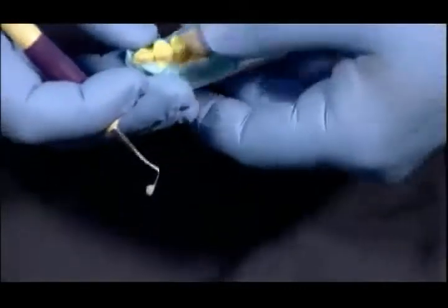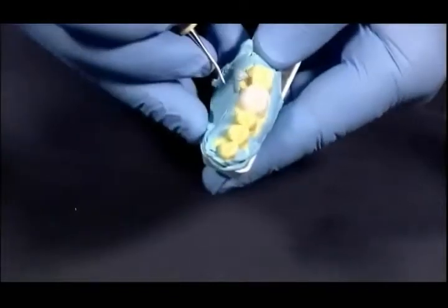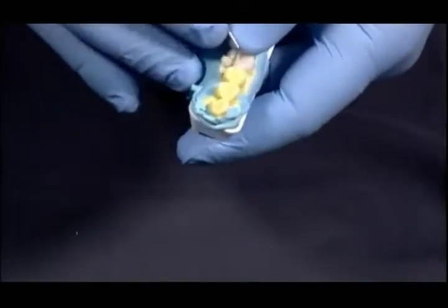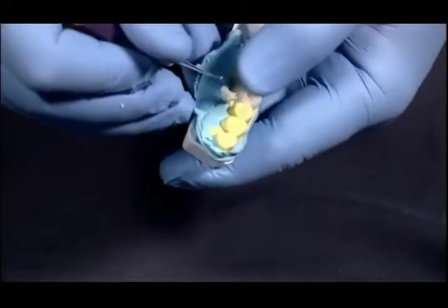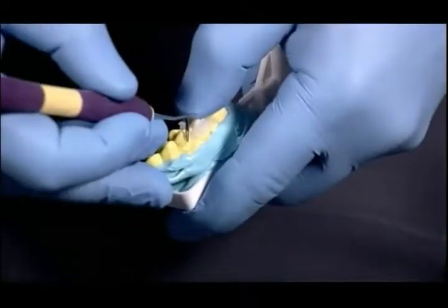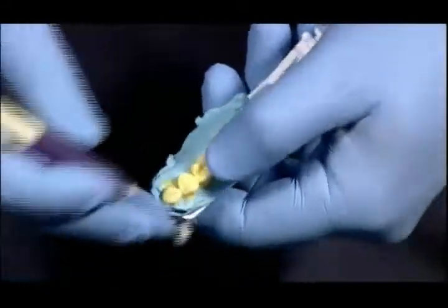As I look at this now, I'm going to drop back a little bit and let you know that I do not have that mesial shaped the way that I want it to. The distal I'm happy with. I can trim that back. The mesial is not shaped appropriately. So what I'll do is go back and get some of my material, and I will add to the restoration to make sure that I get the proper embrasure, because this is going to save you time in the process of finishing and prevent food impaction and give you a much better restoration when you get down to the end.